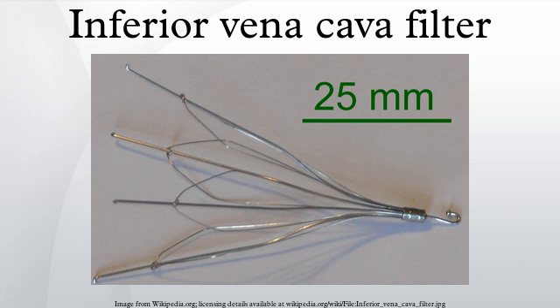Rarely will one find an MRI not safe IVC filter, as most of the steel and other ferromagnetic material devices have been discontinued via the FDA. IVC filters are attached to the vena cava via hooks on their ends. Some are compression springs, which compress outward onto the side wall of the vena cava. However, they still have small hooks that retain their location.